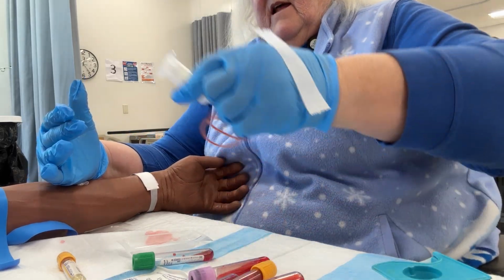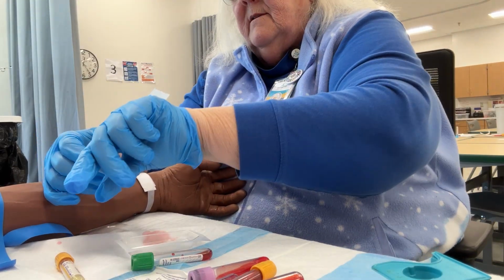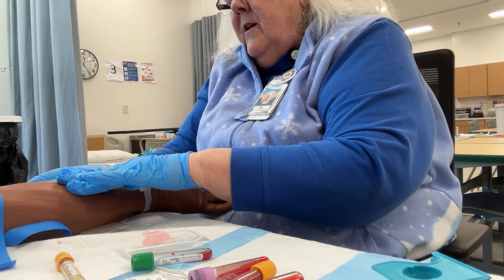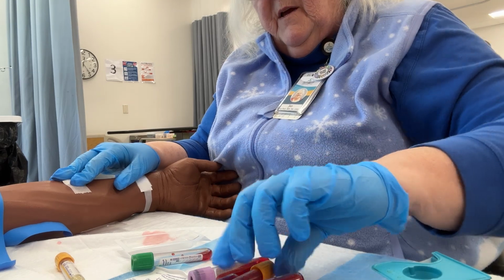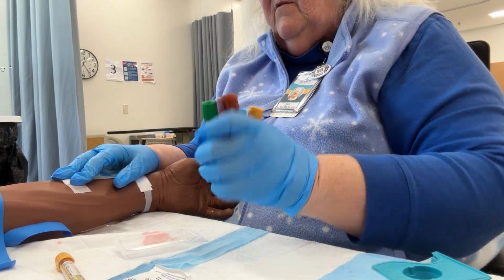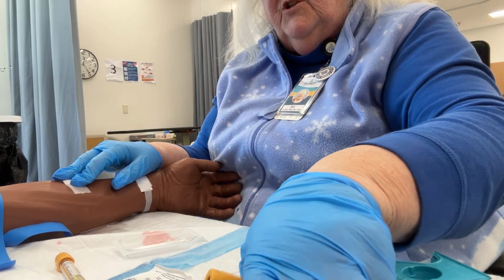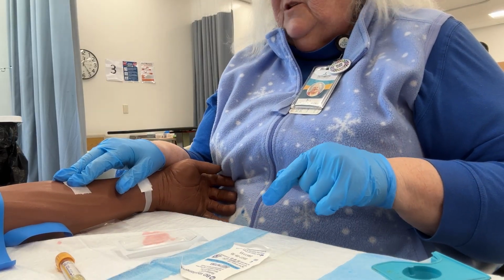I use the side of my hand, keep my pressure while I put that straight in my needle box. Get my tape, put my tape on, and I usually hold for another minute with my tape on, and then I pick up all my tubes and I rotate them all. 1, 2, 3, 4, 5. You do not want to shake tubes because they'll get foamy and it's difficult to run the test.